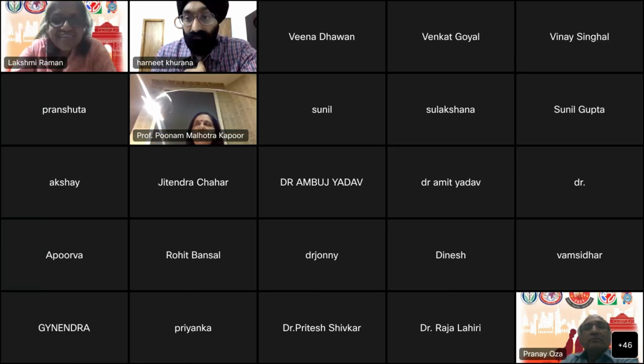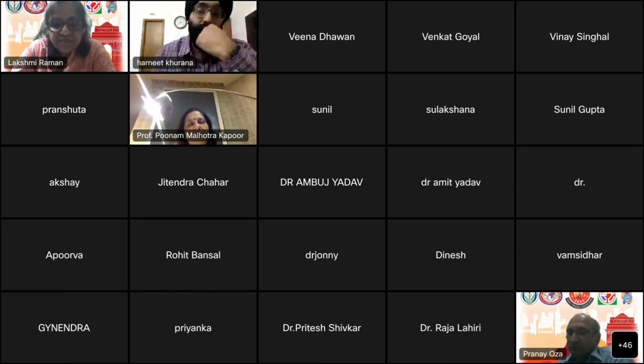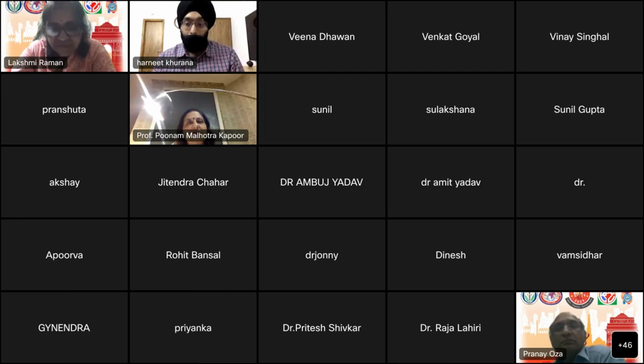We've used bivalirudin in 4 or 5 ECMO patients, and two of our patients had HIT, and that's why we decided to use bivalirudin. All three were on ECMO. They were cases of pulmonary thromboendarterectomy. And patients did very well, but in one patient we had a clot. You just mentioned that clot can form in the LA as well as the RA, a smoke, right? So we saw spontaneous echo contrast.